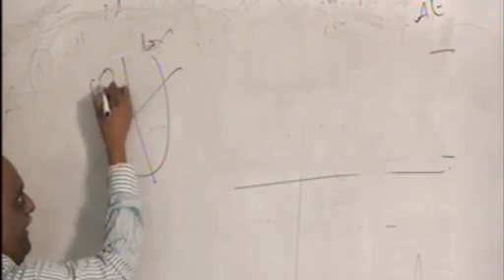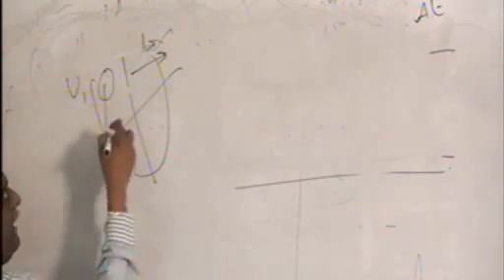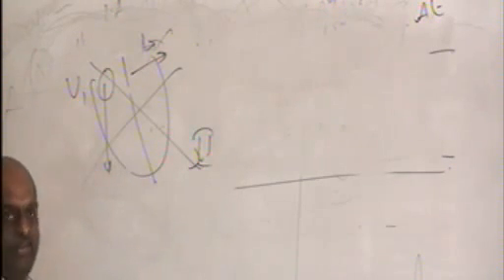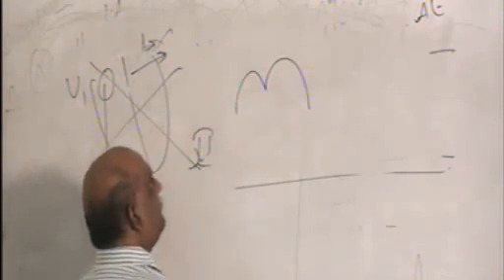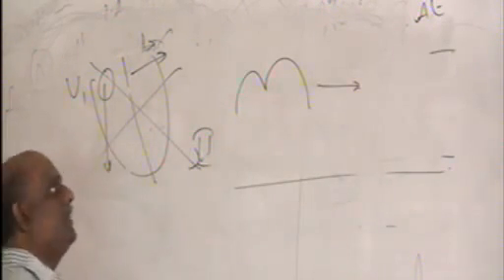A quick recollection of the earlier episode: the right atrium produced like this, the left atrium produced like that, and V1 is a right-sided lead, but lead 2 is going down. Think and tell me, if you find an M pattern, it indicates which chamber enlargement?